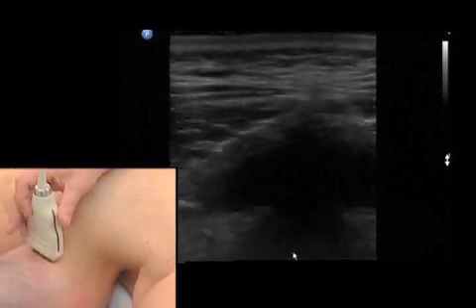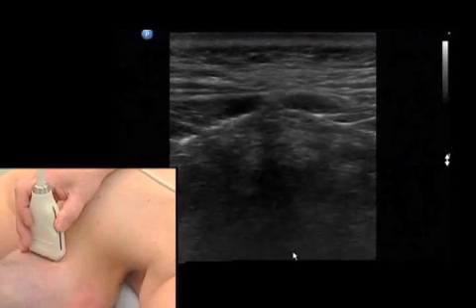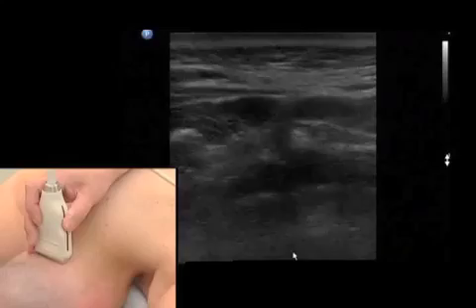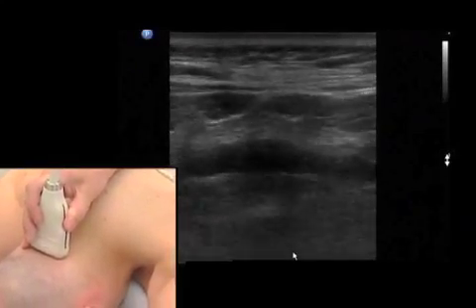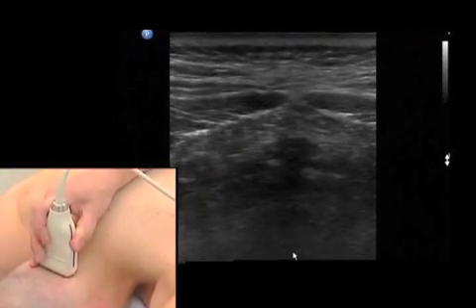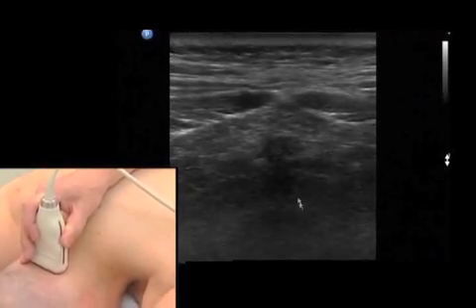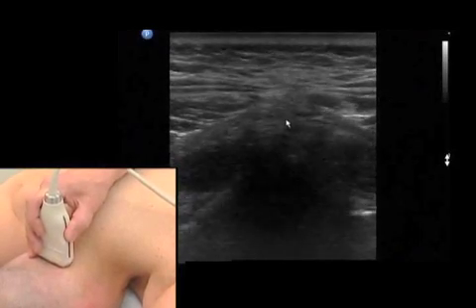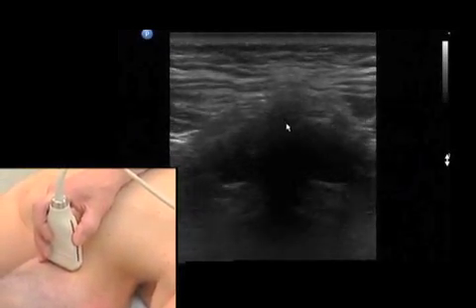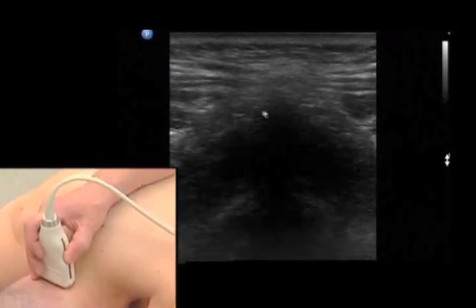I put my transducer right in the middle of the neck, and for beginners, it is good to start just on the occiput, on the occipital bone, because one will clearly see the external occipital protuberance in the ultrasound image, and then gradually move downwards until we see the bone shadow of the atlas.